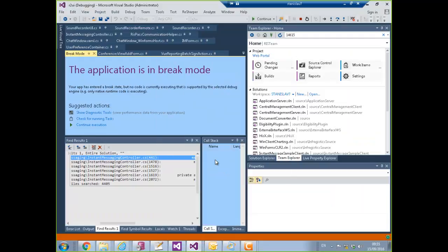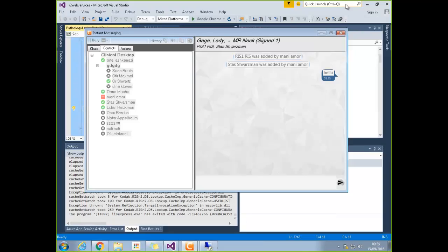That's a very good point about the online status though. It's the main reason of having it. If we can have a friendlier way to build that list or to see who's online and who's not online. The server's down for some reason. I don't know why. Maybe if you hover over the group name, it can display the names and status.